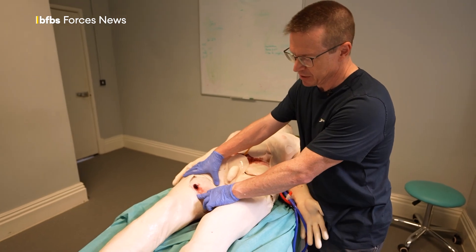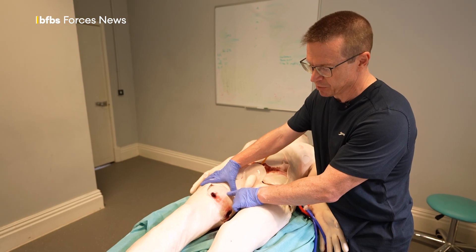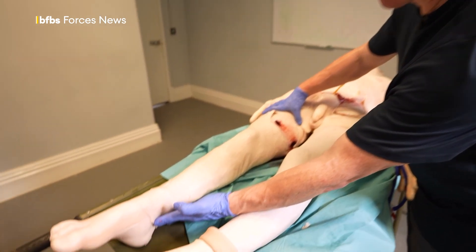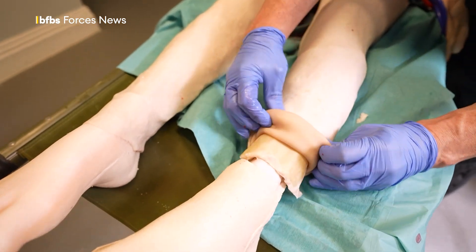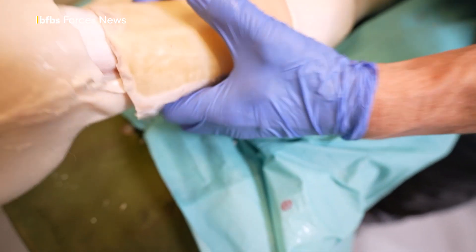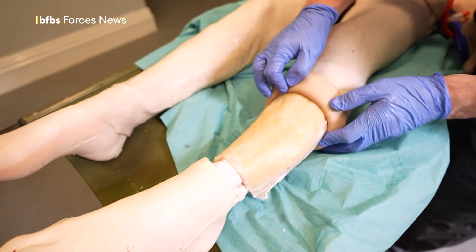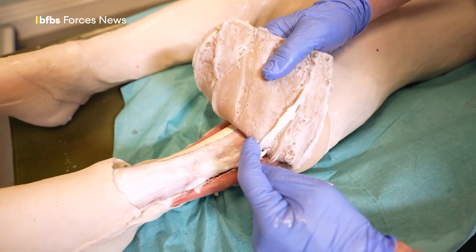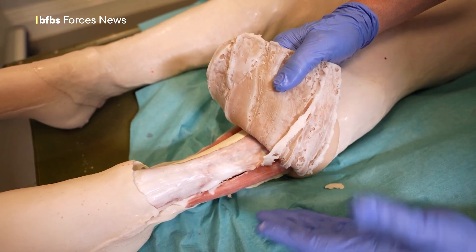Surgeons will then enter and get proximal and distal control, put a shunt in, which is a tube to allow the blood to flow from above the injury to below the injury, then a pulse would return to the leg. I can roll the simulated skin up on this leg to show where the surgeons would be making the incision through the skin, then through the subcutaneous fat, and then once through the fat, they would be dividing the tough covering called fascia to display the muscles underneath and to allow those to swell.